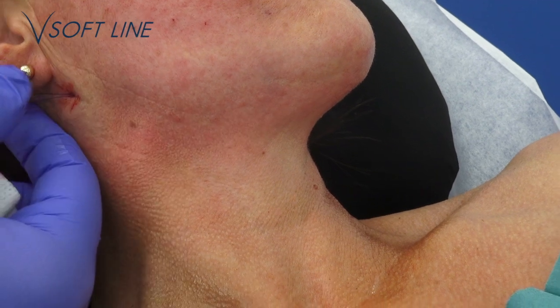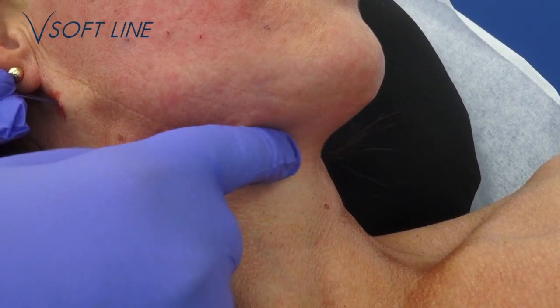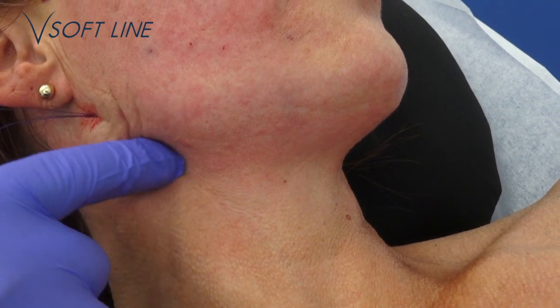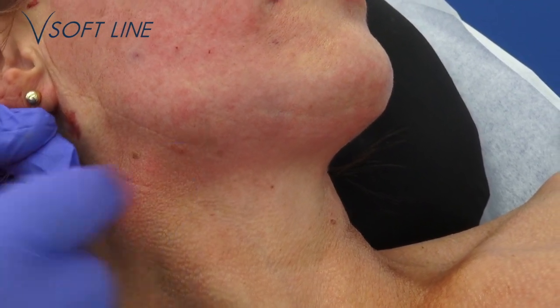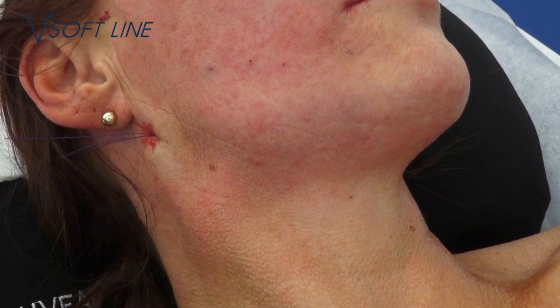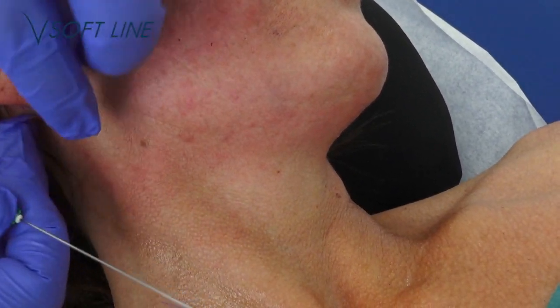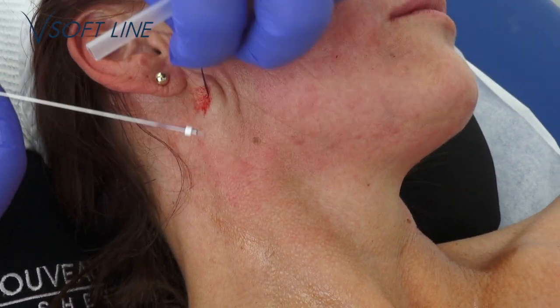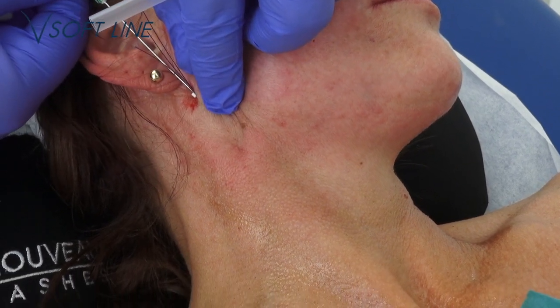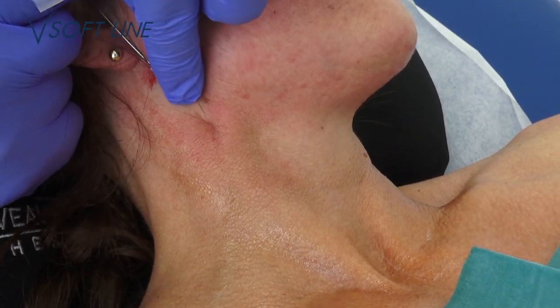Now you can see the lifting effect of all the 3 sutures together. 3 threads define the beautiful contours of jawline and neck. Let's show where we have the end points of the 3 threads. I'm pointing at the ends of the threads, 1, 2, 3, together at the mandible angle. And the last thread here. I place this in parallel with the front part of the sternocleidomastoid muscle here, the muscle here.